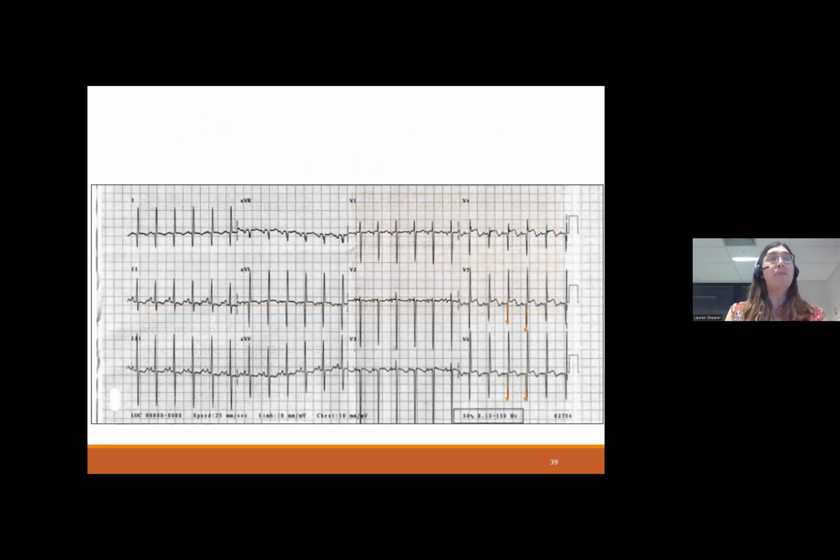Just as an example, this is an ECG in a patient with an anomalous left coronary artery, acknowledging that it's a paediatric ECG, so it's clearly much faster than we would see in an adult. We have widespread ST elevation. We have pathological Q waves laterally. We've got a very bizarre axis. Hopefully if you're seeing ST segments that look like this in any patient, you are worried about the heart. And if you get that to me, we're going to be worried about it too. Sorry, that's just arrows for that as well.